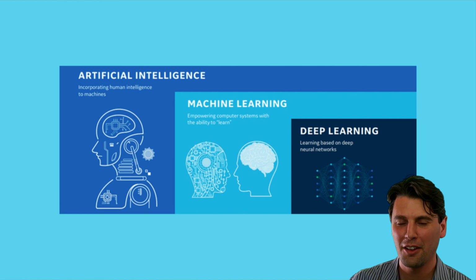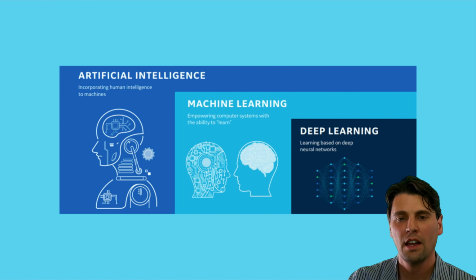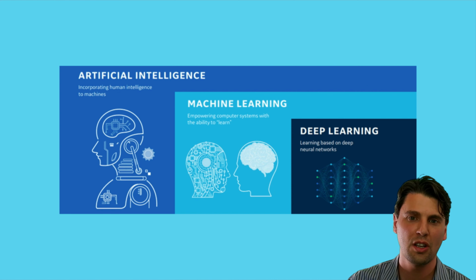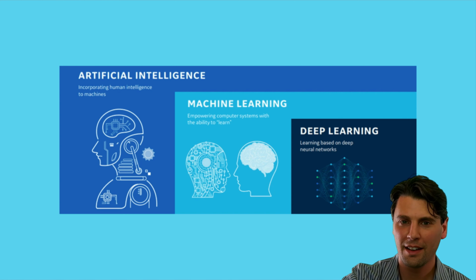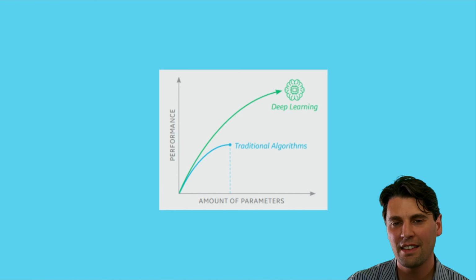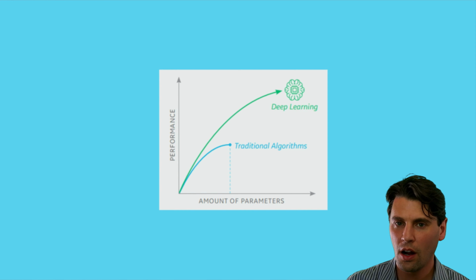So you have artificial intelligence, which is the broader category. Within that, machine learning, then within that, deep learning. And the real advantage of deep learning is that we don't have to train specific filters and identify specific filters to perform tasks, such as in machine learning. The deep learning network can actually train itself, and it is self-sufficient in that sense, as long as you're supervising it properly.